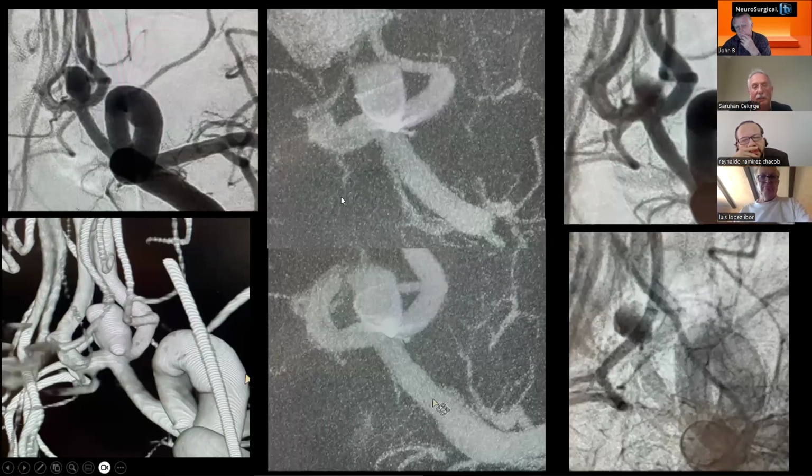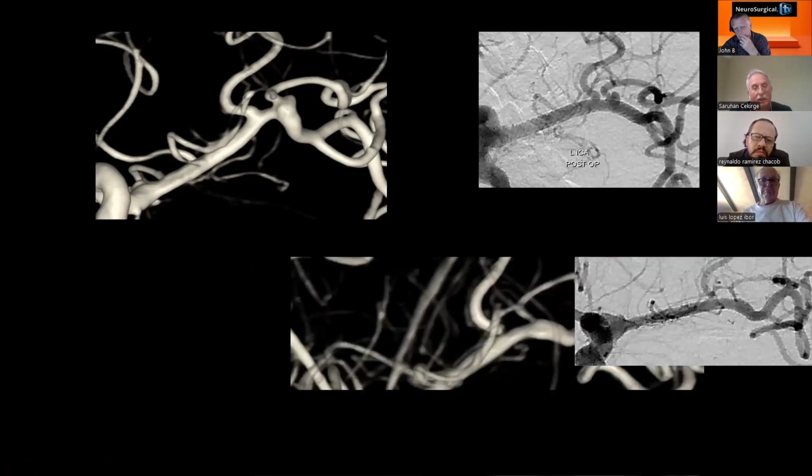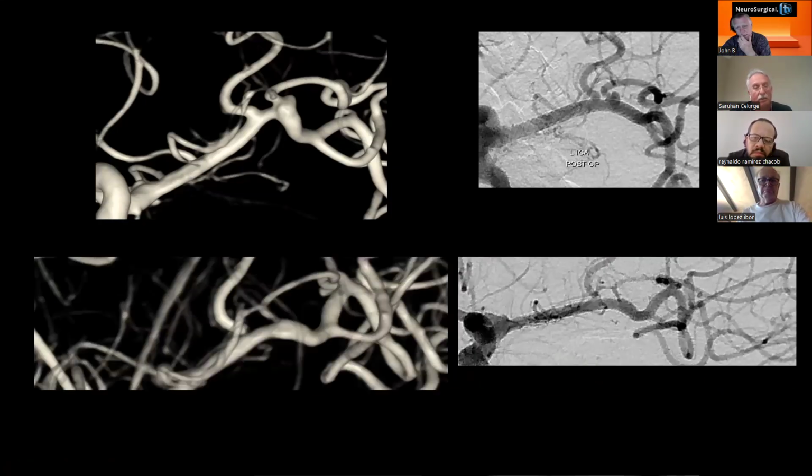I have no idea about this. This is a picture I got from my friend. The Contour device, these bifurcation devices have never been available in our country, so I have no experience, but people are using those as intrasaccular devices. And very rarely we treat ruptured aneurysm with flow diverters, as in this blister-like MCA bifurcation. Okay, so this is something that we don't intend to do, but sometimes we have to.